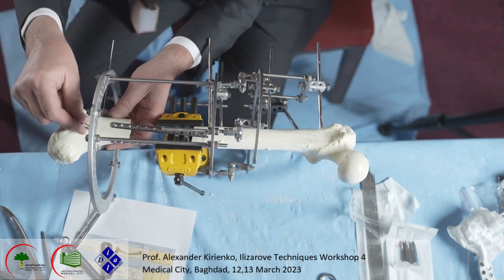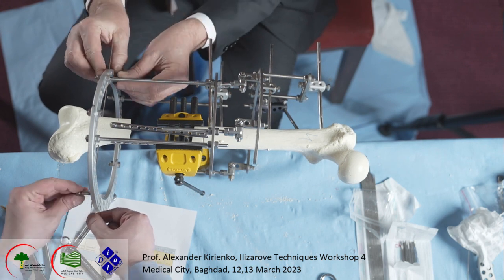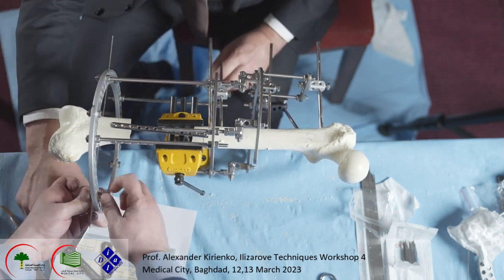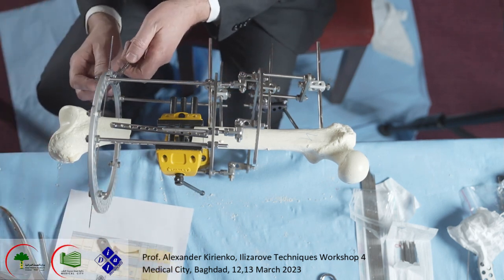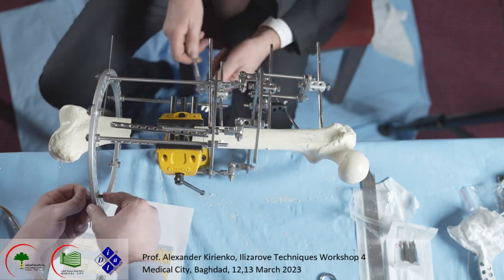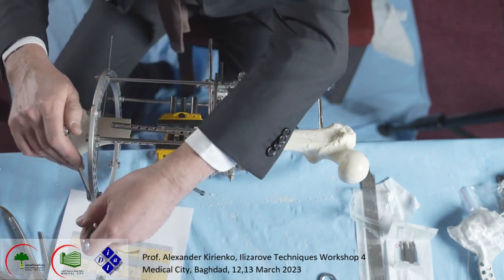Obviously it is better to control the position of this wire in fluoroscopy, because you see the level of the wire, you see where the bone is good, and you see the realignment, like I explained before, that this joint line is inclined at 7 degrees respective to the anatomical axis of the femur. Okay, fix it. Good. Now we fix this.